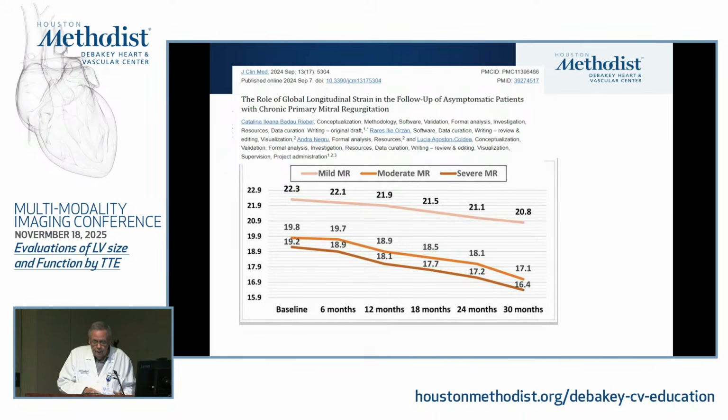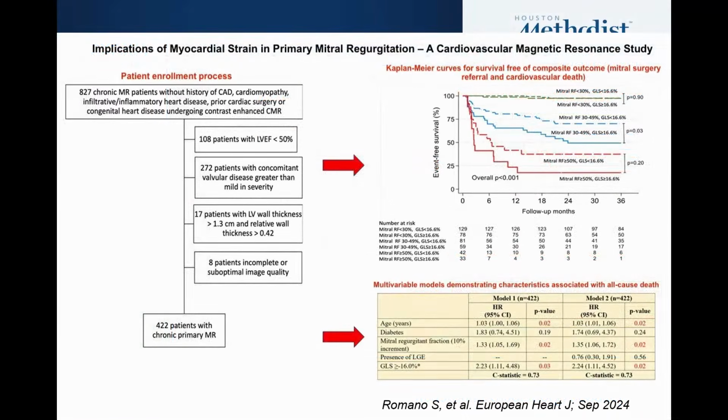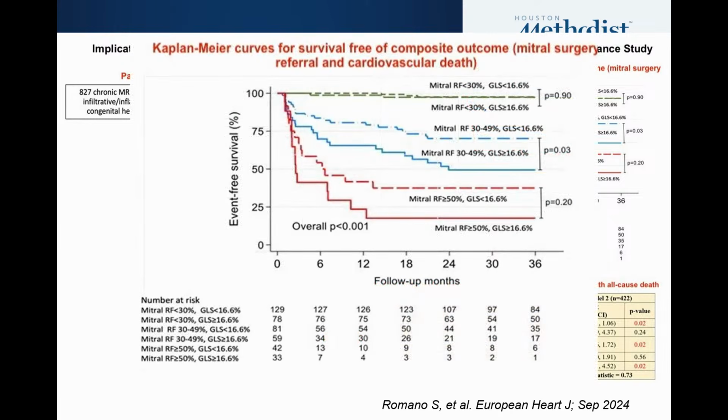This could definitely have, eventually, an impact on clinical decisions in terms of how much to wait, when you have this potential for dropping to levels that we know, once you hit these levels, we have the other previous studies showing that the post-operative course is not as good. And then this is with CMR, just to show that another technology has very similar findings.